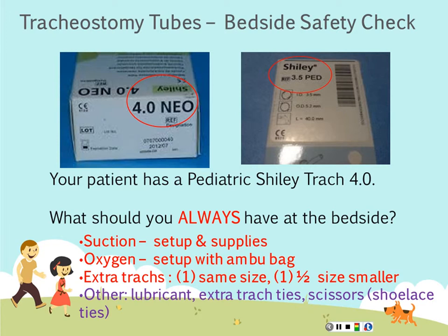airway trauma. You want to have extra trach ties. And then if you've got shoelace ties, you want to make sure that you have scissors available in case those needed to be cut in an emergency.